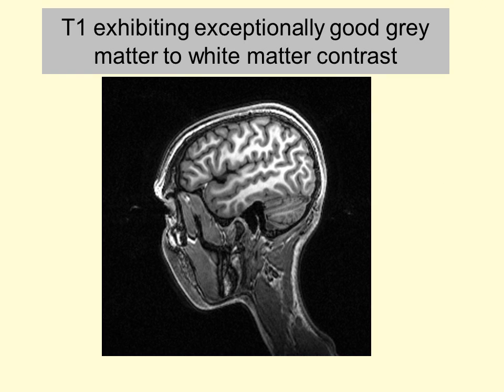Okay, so I just wanted to show you this slide because this is as good as it gets. This is a T1 image that exhibits exceptionally good grey matter to white matter contrast. You can see that I'm able to zoom the image in a lot more because there's a lot more native spatial resolution in the image, and you can see that I'm tracing with my red dot around the white matter really easily here, and it's really easy to see the difference between the white matter and the grey matter. Now this was acquired in the scanner using a sequence called an MDEFT, in contrast to the image on the previous slide, which was I think an MP-RAGE standard sequence.